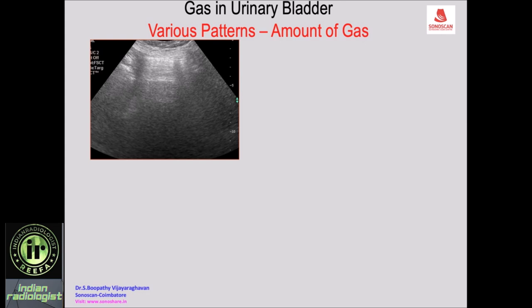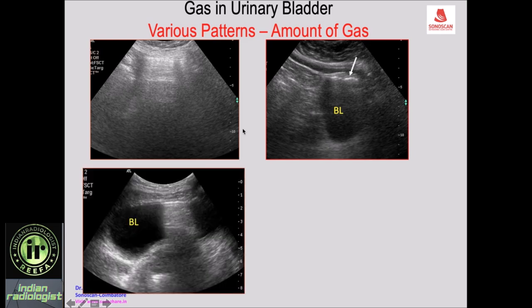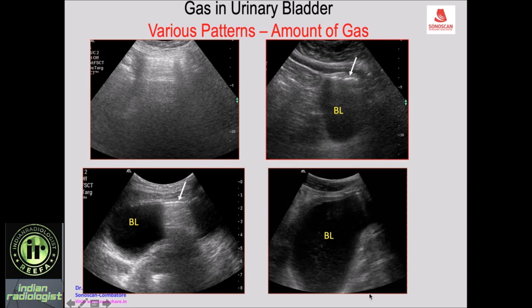The appearance on ultrasound varies depending on the amount of gas. With a significant amount, gas is seen in the anterior part with heavy shadowing masking the entire bladder. With a moderate amount, only the anterior part is affected and the rest of the bladder is visible. With even less gas, you can see almost the entire bladder with just a single bubble producing a dirty shadow — so a single bubble of gas within the urinary bladder can be detected.